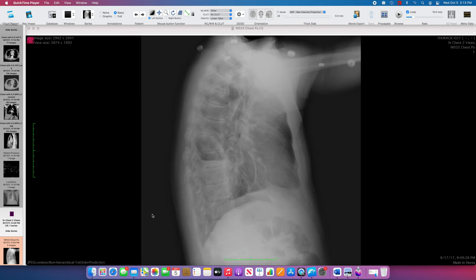Looking at the lateral exam, this has something called the spine sign, or positive spine sign. The thoracic spine should get more and more radiolucent as we go inferiorly. And here we have this abrupt linear border that transitions from what we would generally see as normal thoracic spine to an opacification in the lower spine.